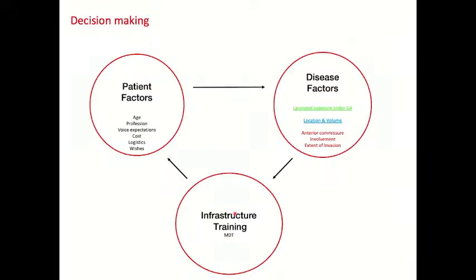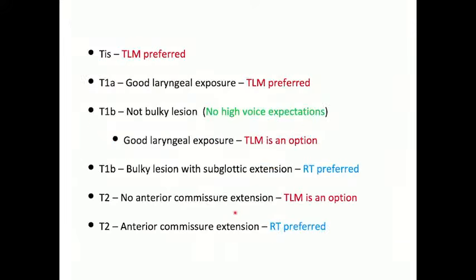And of course the team, the MDT. When we started laser surgery at our hospital, the radiation oncologist used to tell us Akshay is doing unethical treatment for patients. So what is important is to gain their confidence. How do we gain it? Take the videos, put them in the tumor board, take the follow-up videos, show them to them, right? Then slowly, whenever they have a friend or relative, they would refer the patient for laser surgery. They would still treat other patients with radiotherapy, but if it's his father, uncle, someone, sister, they still send them for transoral laser surgery.